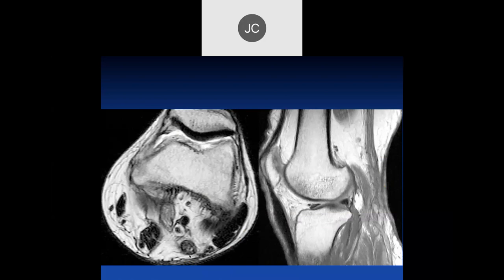If you see generally thickened nerves peripherally, what diseases do you think about? The median nerve, there's like a hamartoma that we saw. That's just a thickened nerve. Well, let's just say, for instance, all the nerves of the lower extremities were thickened. That's not the case here, but what would you think about? Is it Charcot-Marie-Tooth? Yeah.